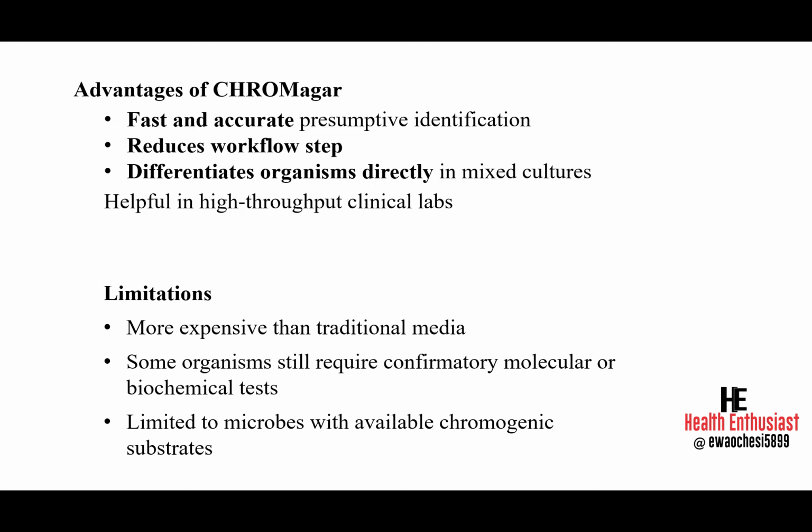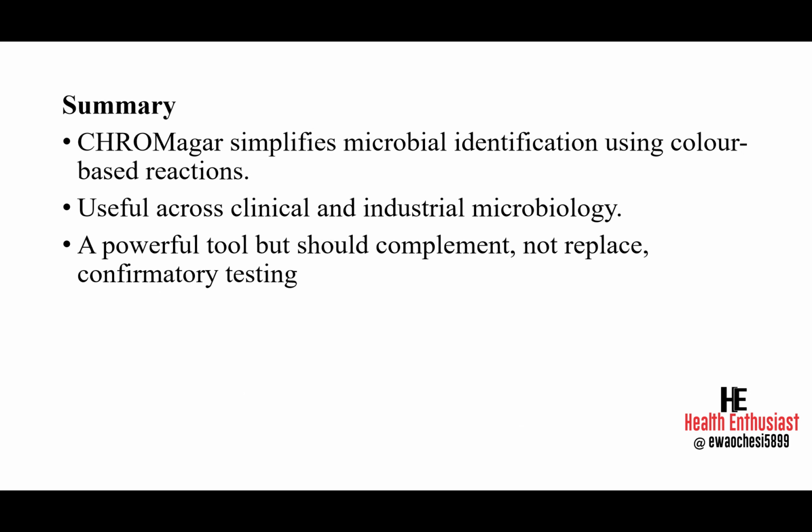So it's not as if CHROMagar will take over the molecular test. We need to go for the molecular test, which is the gold standard test for microbial identification. Of course, another limitation is that they are limited to microorganisms with available chromogenic substrates, right?